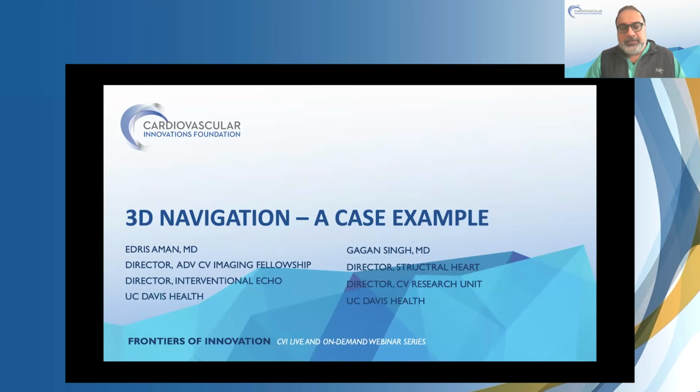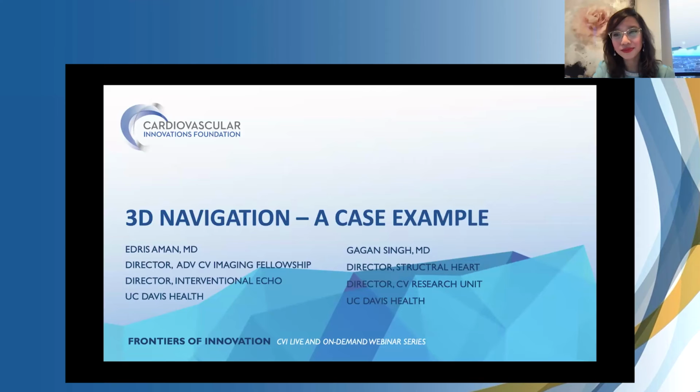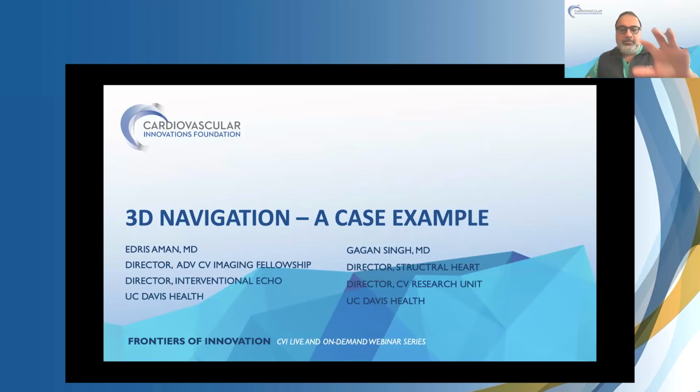As interventionalists, Paul will attest to this. We have the most patients out of anybody in any procedure room, right, Paul? So we have tons of patients. One of the things that's really interesting about ICE imaging is, unlike TE imaging, Nadira and Edris, you guys have the TE probe and then you're manipulating the console at the same time. Sometimes you're doing one and the other, but you control both.